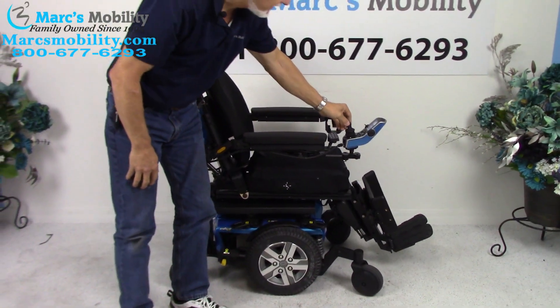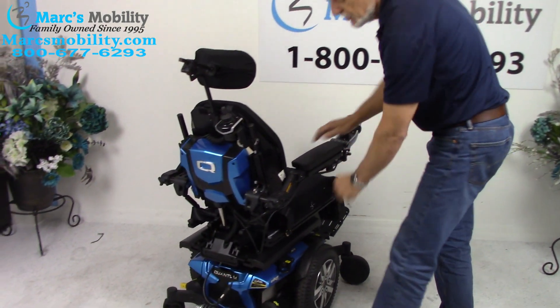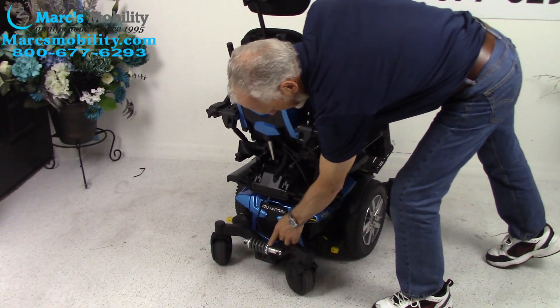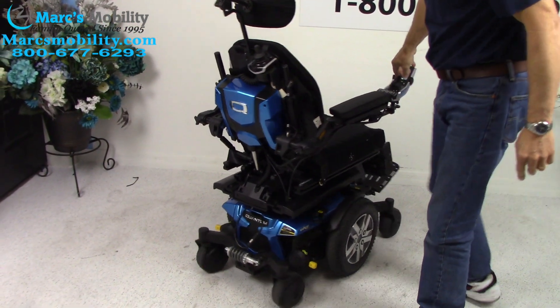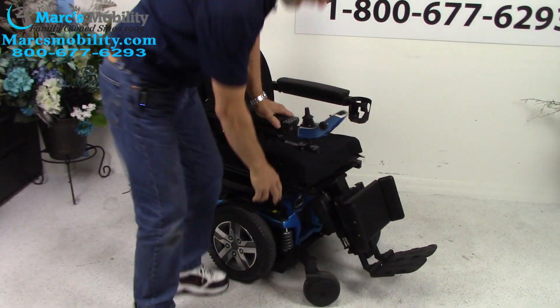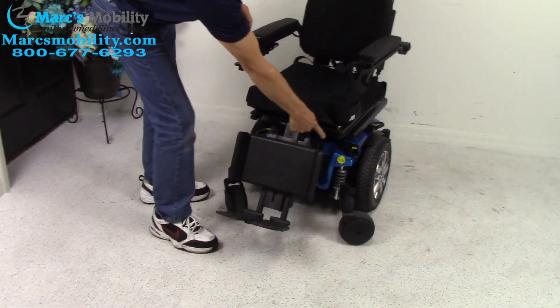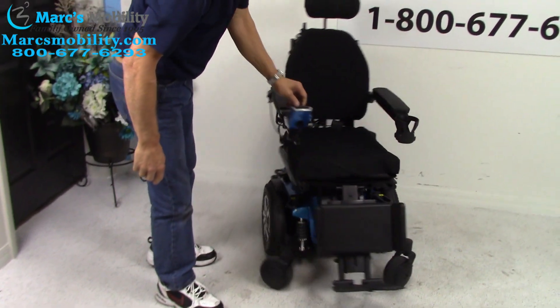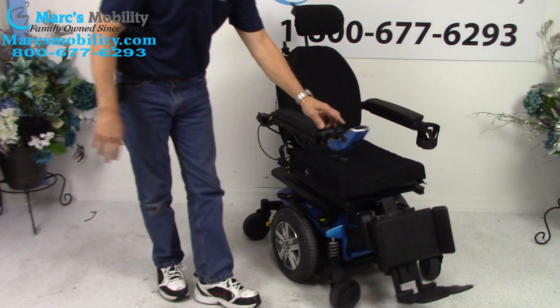The suspension on this chair is fantastic. You can see the suspension in the back — it's adjustable. You have the same suspension in front: two of those in front actually, one on each side. You also have double suspension in front. This is why these chairs have such good suspension.